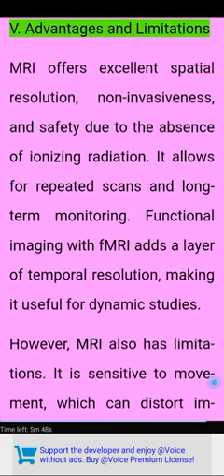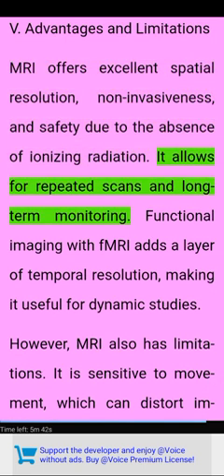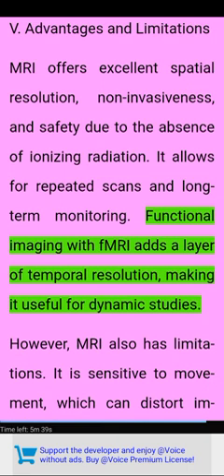5. Advantages and limitations. MRI offers excellent spatial resolution, non-invasiveness, and safety due to the absence of ionizing radiation. It allows for repeated scans and long-term monitoring. Functional imaging with fMRI adds a layer of temporal resolution, making it useful for dynamic studies.